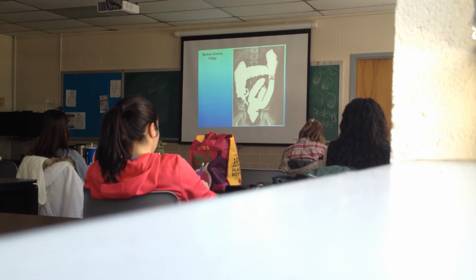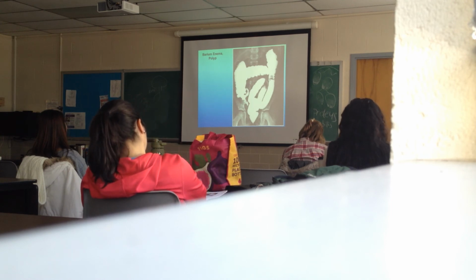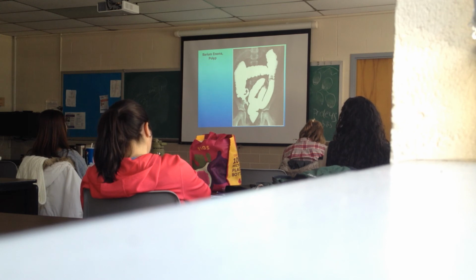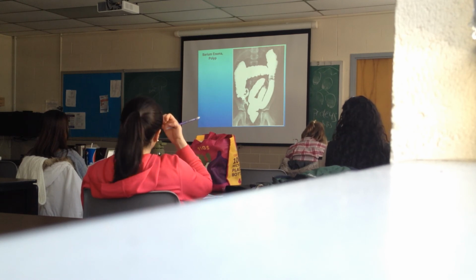Here's a single contrast study. A redundant sigmoid colon here. Okay. What's that? What's this? That's a terminal ileum.